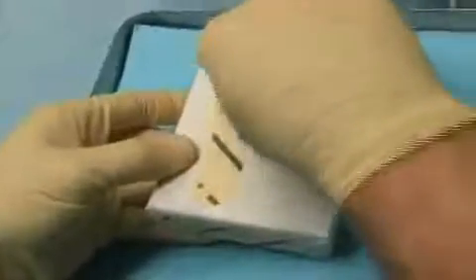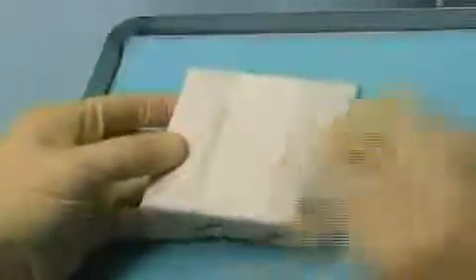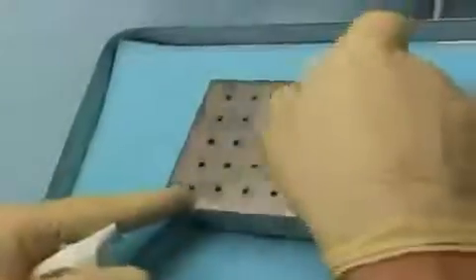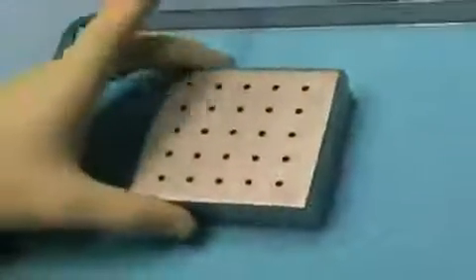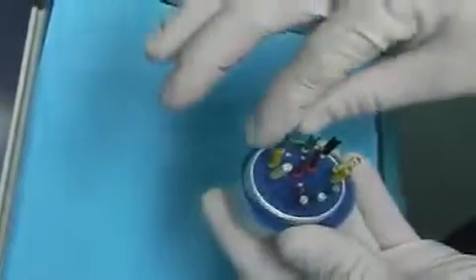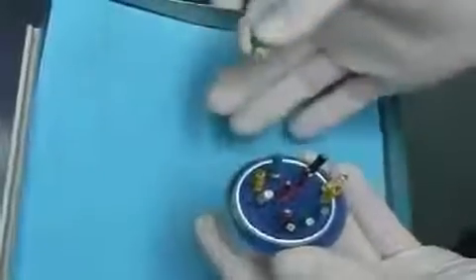Furthermore, it's very important to work with sterile instruments. Here you see a root canal treatment box wrapped to preserve its sterility. It's opened just prior to the root canal treatment. The various instruments are neatly arranged. However, in far too many cases, root canal work is performed with unsterile instruments. Instruments are placed openly in simple foam rubber racks, as seen in the image here.